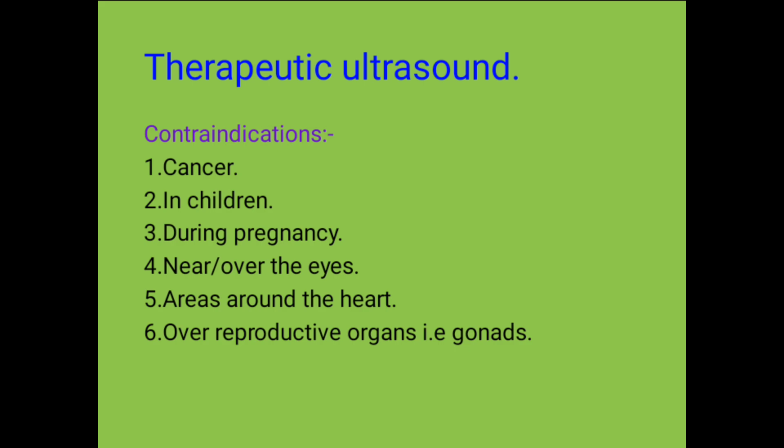For instance, in cancer, you should not use therapeutic ultrasound because first of all, it will increase cellular activity. So those unwanted cancerous cells will be actively dividing, and it will also increase metastasis of these cancerous cells. So that's why it is contraindicated for cancer.